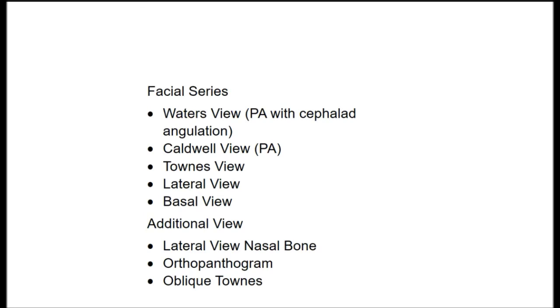I just want to go over a few things today so we can discuss some techniques and images that will help us when we're trying to image the facial structure. So whether we're imaging for facial trauma or sinus disease or even possible infection, there are different images that we want to make sure that we take so we can get the most information possible.